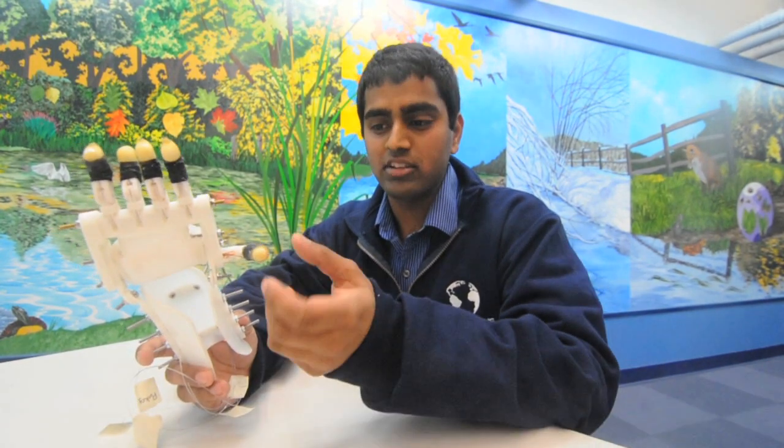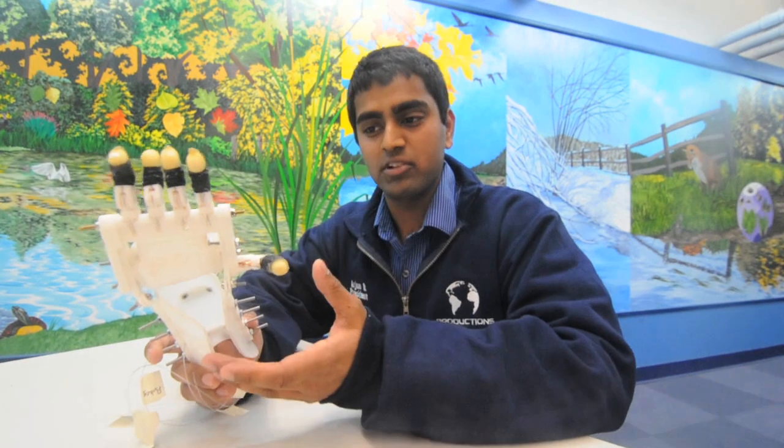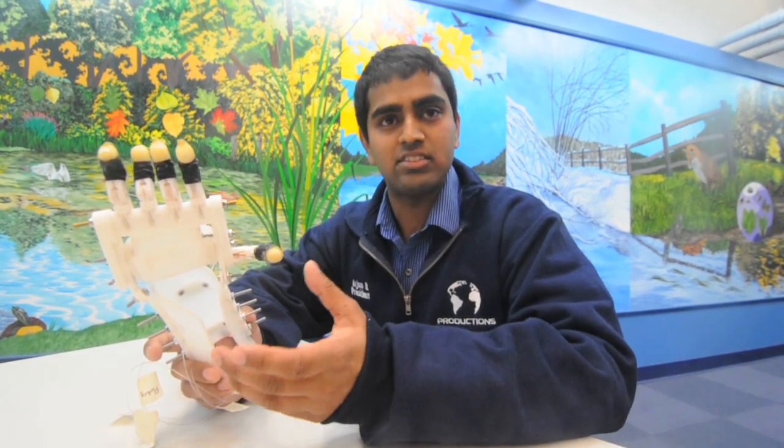Since November, I've been working on printing all these little gadgets, knuckles, everything, and we could put it together in the past few weeks. What you can see now is the RoboHand, which functions based on Max's wrist.